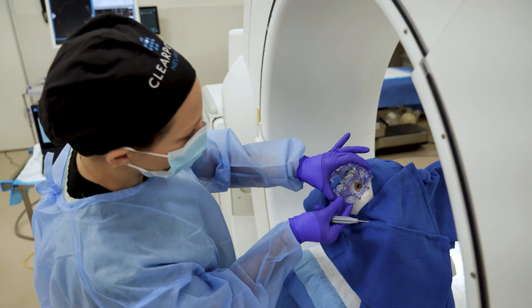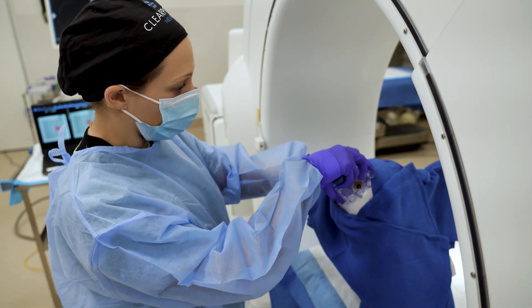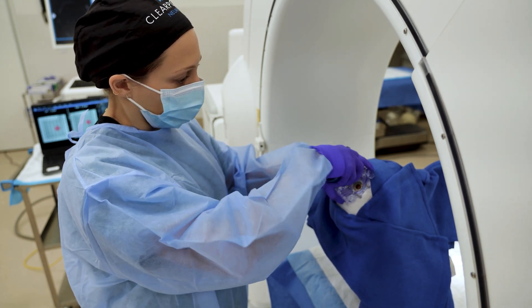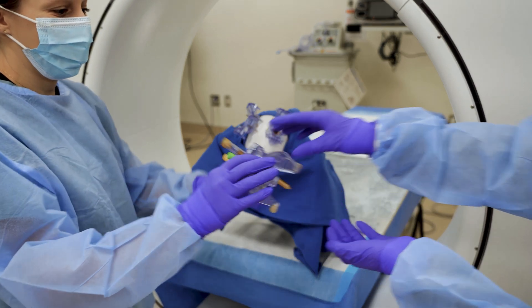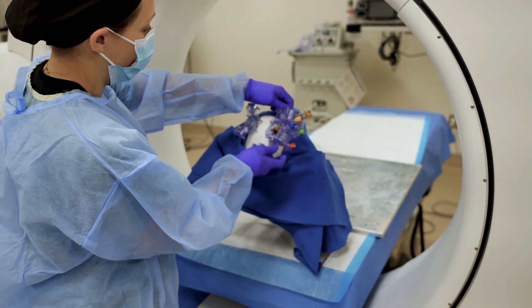There are three kitting options for completing the procedure. One: unilateral. Two: bilateral sequential, completing two sides sequentially using two mounts with a single tower. Or three: bilateral simultaneous, in which two mounts and two towers are used simultaneously.